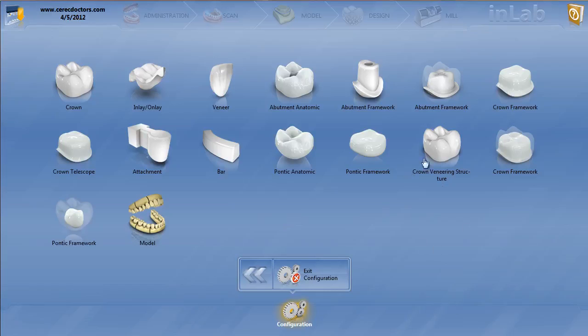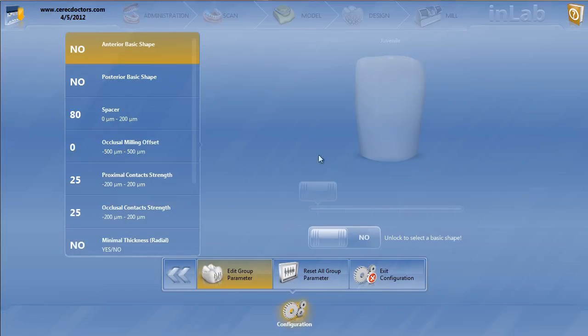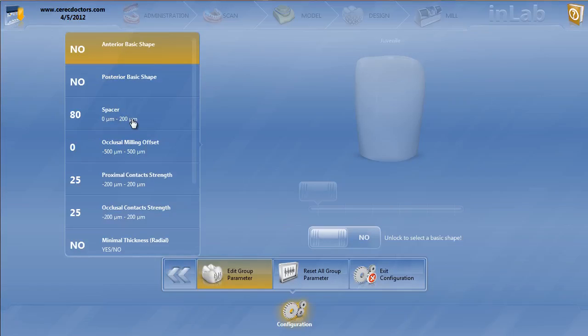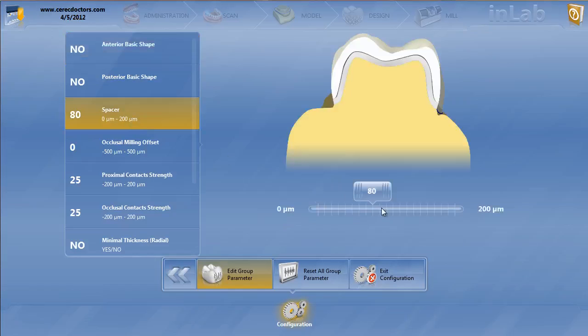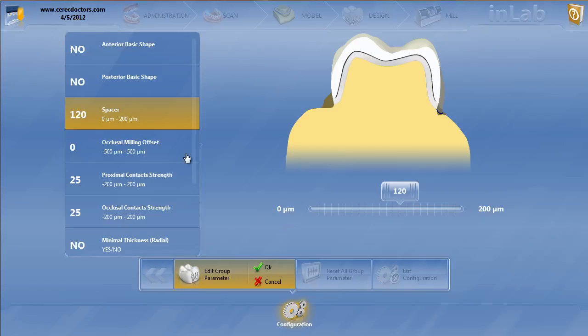These are going to be the veneering structures over the top of the multilayer frameworks. You have a lot of the similar parameters you're used to seeing. We've already been through many times anterior basic shape and the posterior basic shape. Now, the spacer—remember, these are going over the top of that reduced framework. So you're going to need to give it a little bit more spacer in order to fit snugly over the top of that framework. So we'll move that to 120.